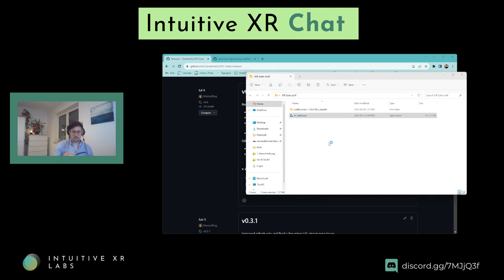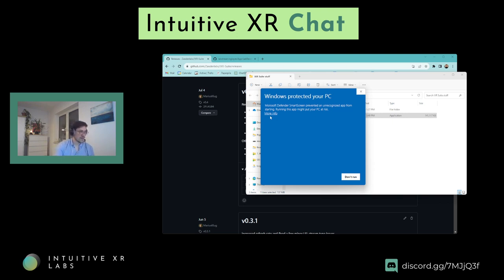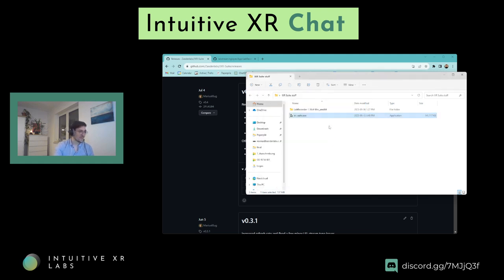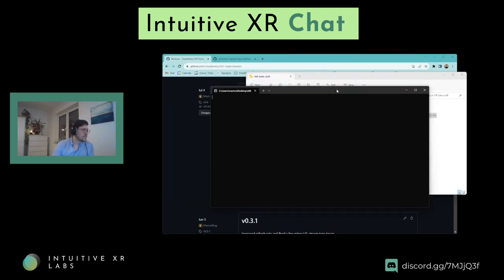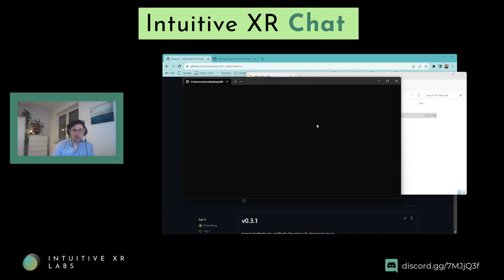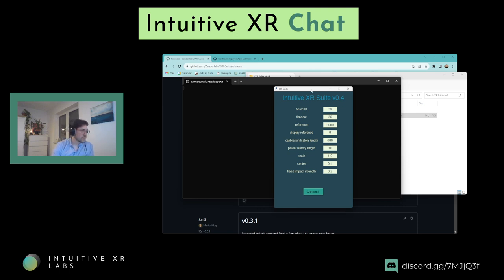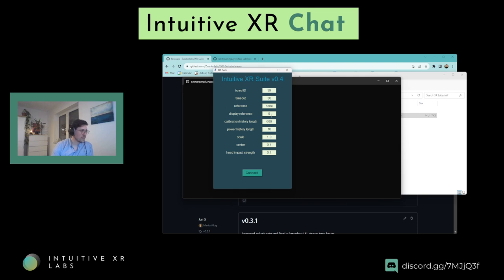If we start the IXR Suite and switch on the Muse, the first time you run it you'll get an insecure provider or unknown publisher warning — that's me, so if you trust me you can run it. The IXR Suite takes a while to boot because it needs to load all the background files and libraries. If you have a Muse like this, you can leave the board ID at 39. If you have different devices, you can use a separate board ID.